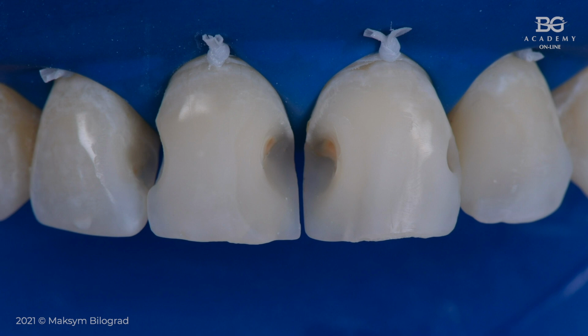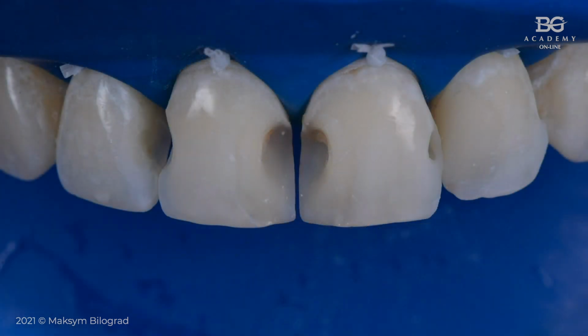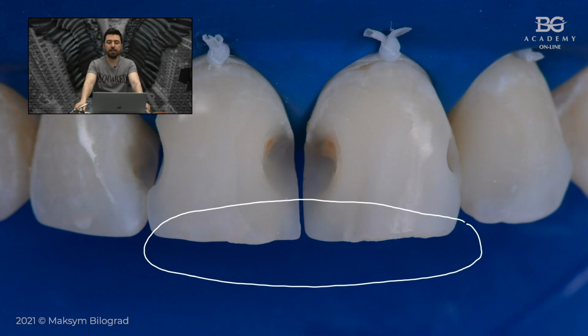But what I'm trying to say now is that after sandblasting you may see that type of enamel here, or it can also be visible not just after sandblasting, it can also be visible after preparation. So if you see sharp angles or a rough surface, you have to be careful, because when you bond your composite or ceramic veneer or whatever, every single sharp internal angle creates stress during the polymerization process.